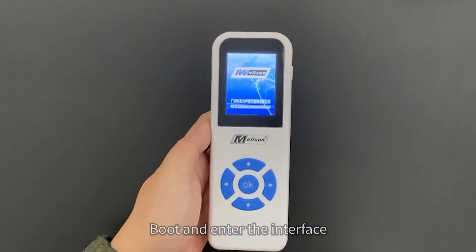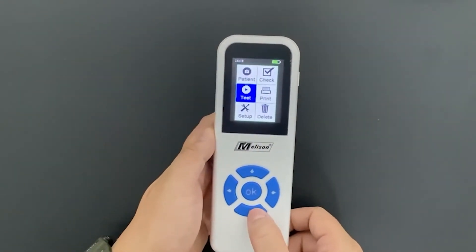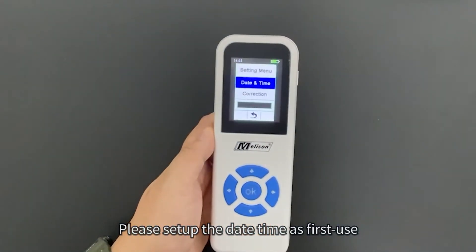Boot the device and enter the interface. On first use, please set up the date and time.